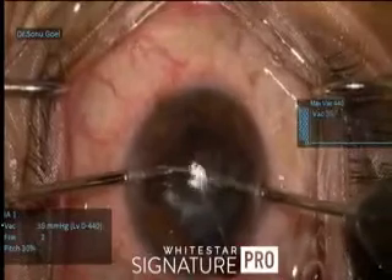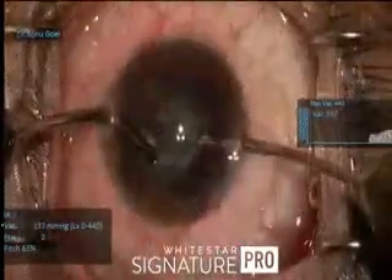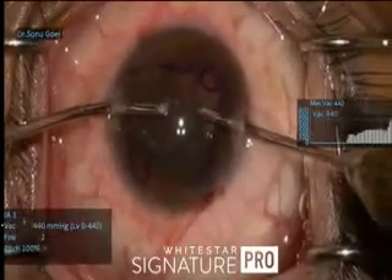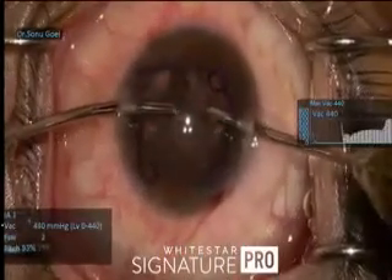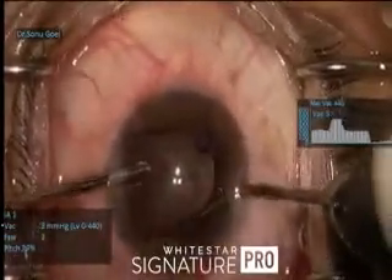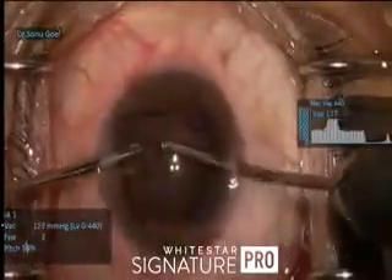Irrigation and aspiration comes as a rescue, removing all the cortical matter very carefully, because it could be a posterior polar element. Polishing is quite debatable in these circumstances, but I always try to risk it and polish as far as possible.